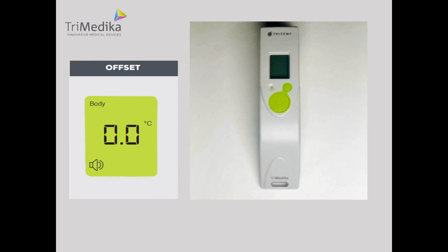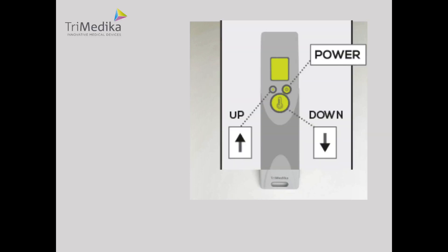We use the buttons on the Tritemp to go through the settings as follows. The power button is the OK button, the read button is the down button, and the adjust button is the up button.